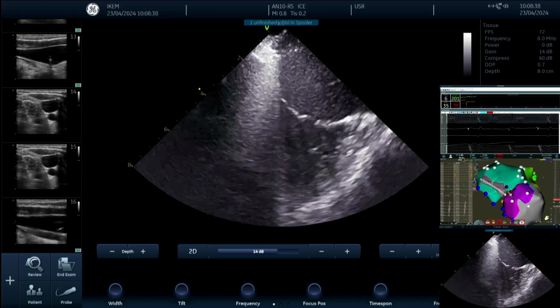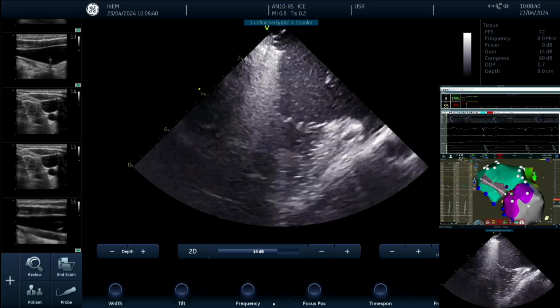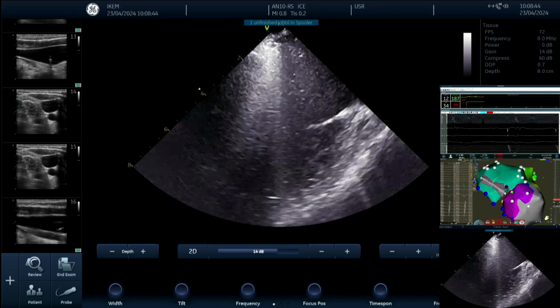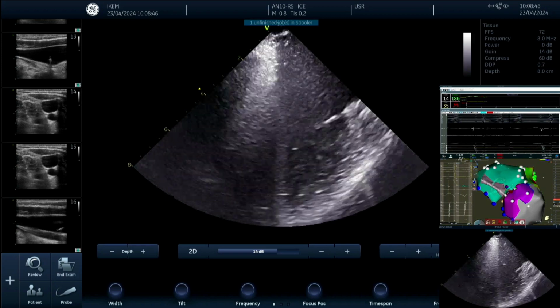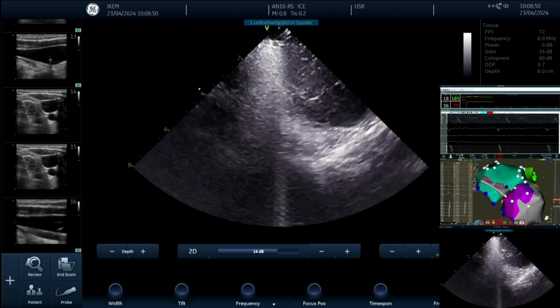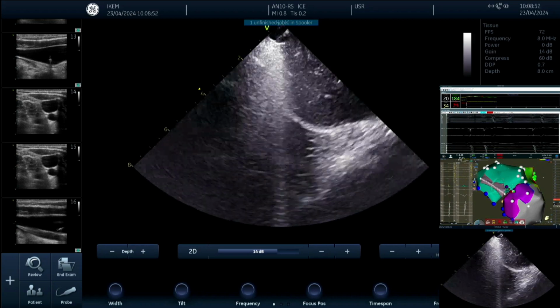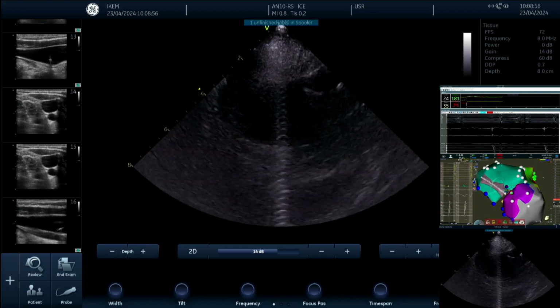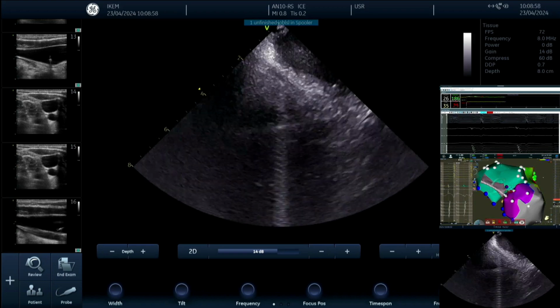And the beauty of this study is that there is a sub-study which is run in Prague in both our centers, and we have, I think, more than 100 patients who have, during these ablations, extracardiac vagal stimulation. So we know exactly that these patients had or did not have this GP ablation.